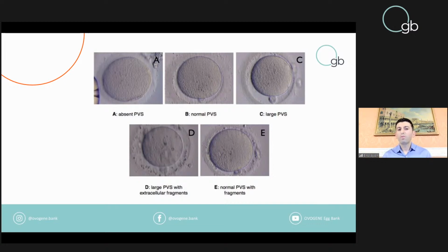And when you try to thaw oocytes, most of you find out that it is easy. In the TS solution, oocytes start to get bigger and start to degenerate because of a very high cryoprotectant concentration inside the cytoplasm. And when you try to thaw with a different molarity of the washing solution, it gets directly damaged. A large perivitelline space always gives a low fertilization rate, and high cryoprotectant concentration directly makes damage here.